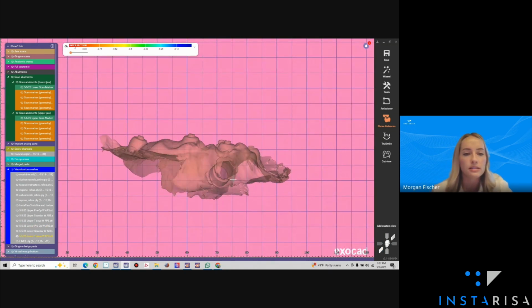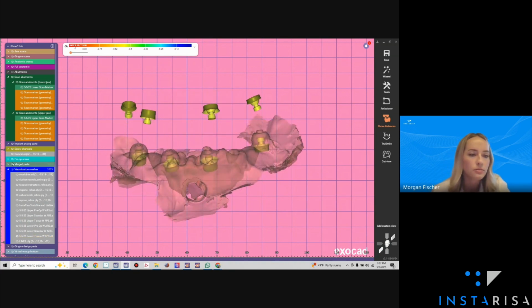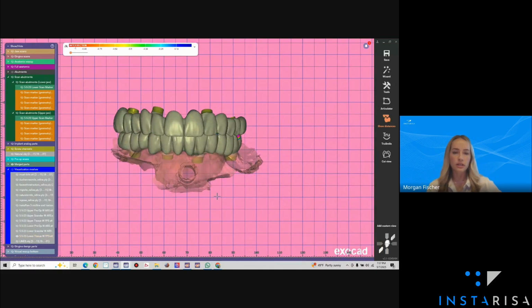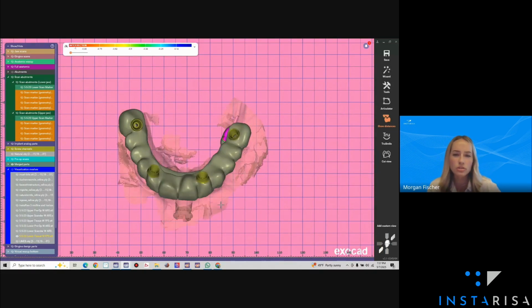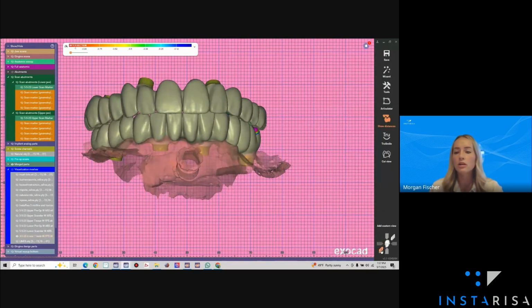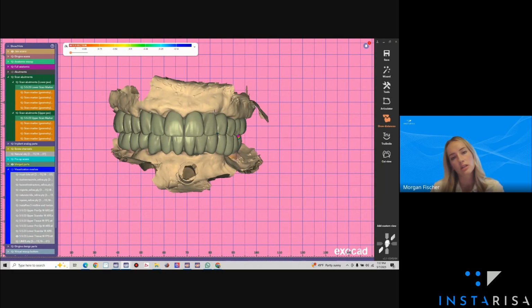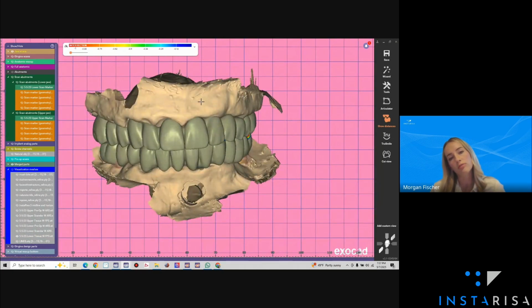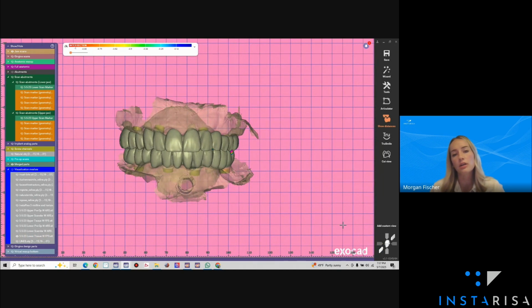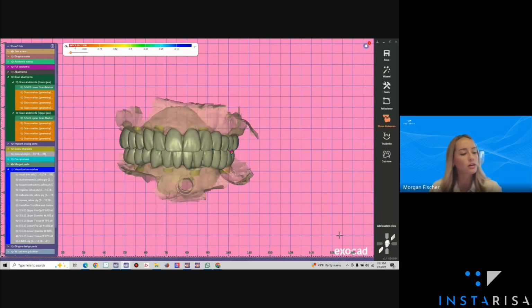So the nice thing about this is these implants were placed super subgingivally. So we were able to get really nice emergence profiles here. This was done with TRI implants. So I believe, no, just kidding. I was thinking of another case. This was done with a normal multi-unit. So we have nice subgingival structures here with ovate pontics. Peter had communicated the pontic workflow, exactly what the doctor wanted, with tissue pressure as well.